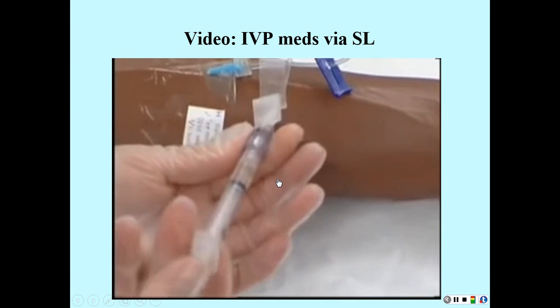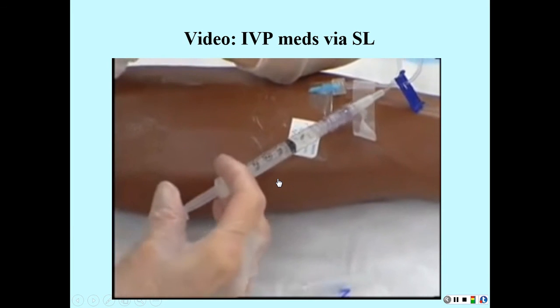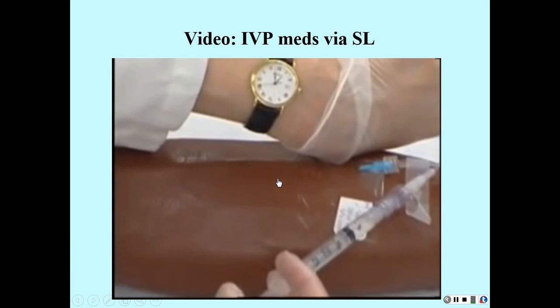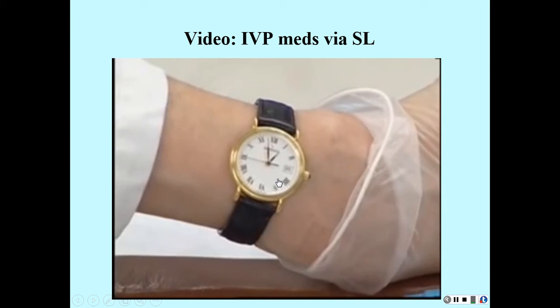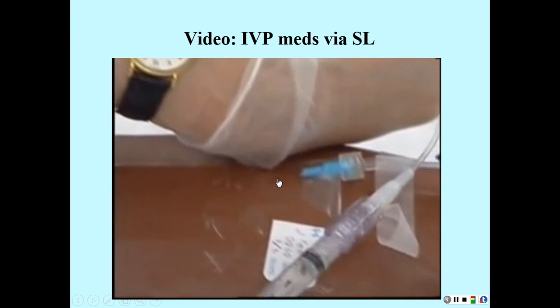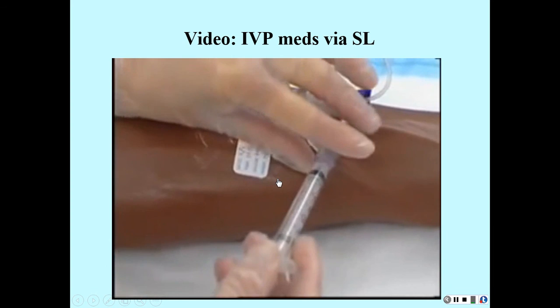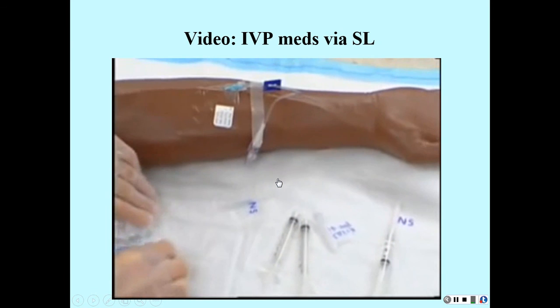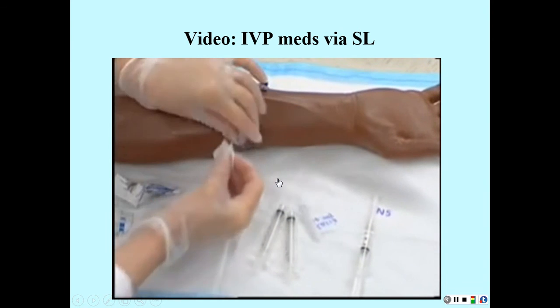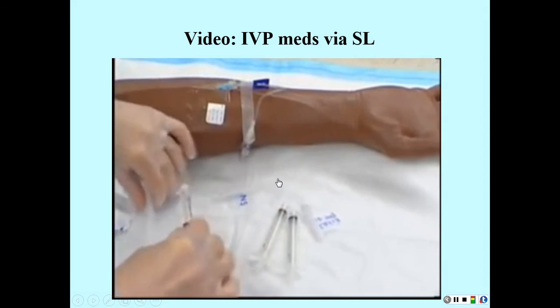And inject medication into vein. Timing injection administration rate according to drug manufacturer's instructions. Observe client for any adverse reactions. Remove medication syringe. Flush with second saline syringe to clear line and maintain patency of lock.